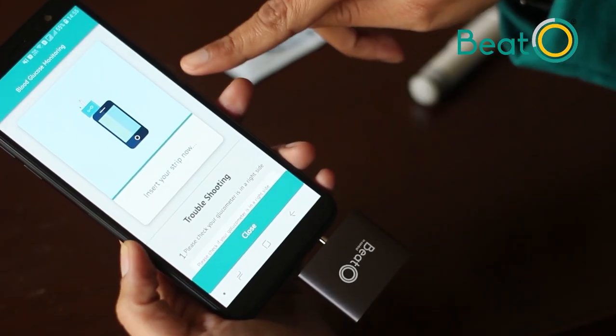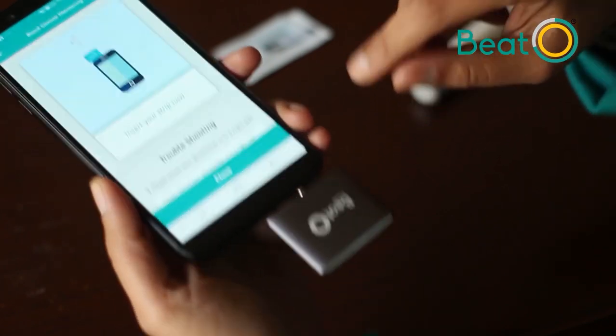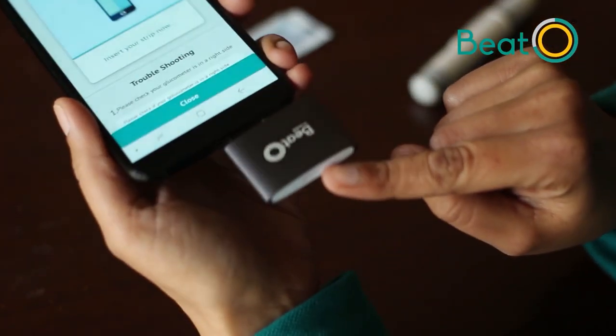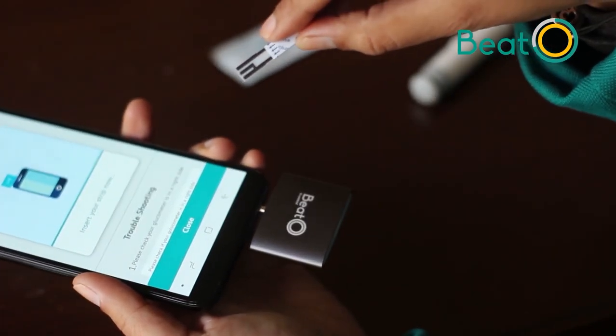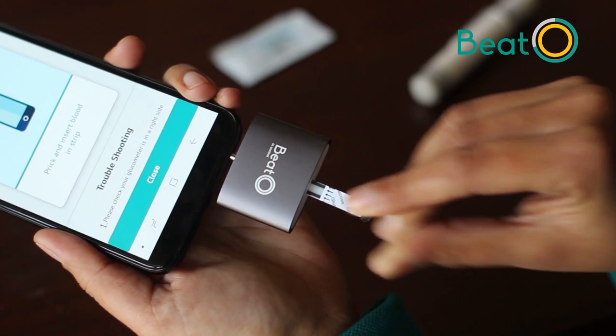After inserting the glucometer, you will get a message to insert your strip. The strip goes into the strip port on the glucometer. Take your strip, follow the arrows, and simply plug it into the glucometer.